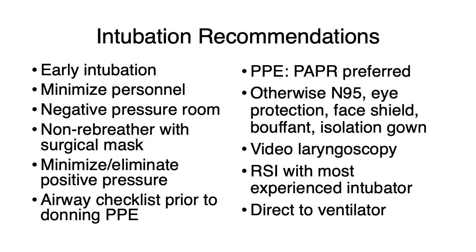As a result of this, we may need to change how we approach intubation in these patients. The decision to intubate should be made earlier, both because the patients can decompensate quickly, as well as the amount of time required to don the appropriate PPE and prepare to get in the room. We need to minimize personnel involved in the procedure. It should be performed in a negative pressure room. The patient can be pre-oxygenated with a non-rebreather and a surgical mask, either over or, in my opinion, it's preferable to put under the non-rebreather mask directly on the patient. We should eliminate as much positive pressure ventilation as we can, including BVM breaths.